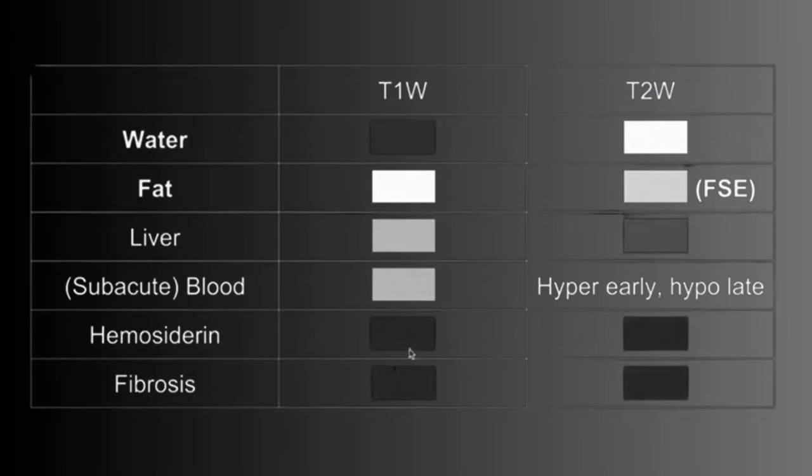Okay, basically we are contrasting. So this is a matter of contrast between black and white. If you reduce the signal of fat, you can make water whiter, right? So heavily T2 weighted images or fat saturated images: either you multiply the water's T2 or you subtract fat's T2. That is how you can make T2 more heavy. So fat saturated T2 images will not show fat as white, it will show fat as black.